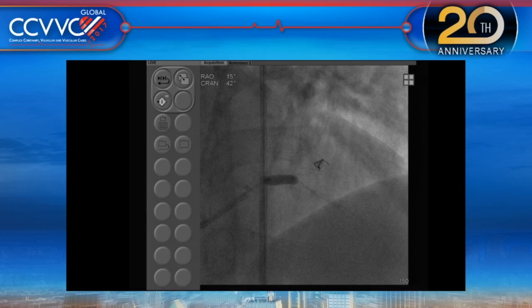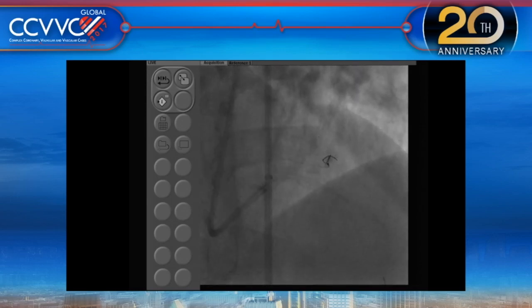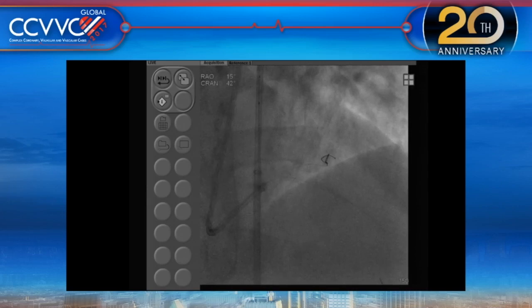We know the arc of calcium, and IVUS tells you moderate calcium, severe calcium, whether 90 degrees, 180 or more, while OCT definitely tells the depth of the calcium, which IVUS doesn't tell. But we can use quadrants, whether you have 1, 2 or 3 quadrants of calcium, for a calcific lesion.